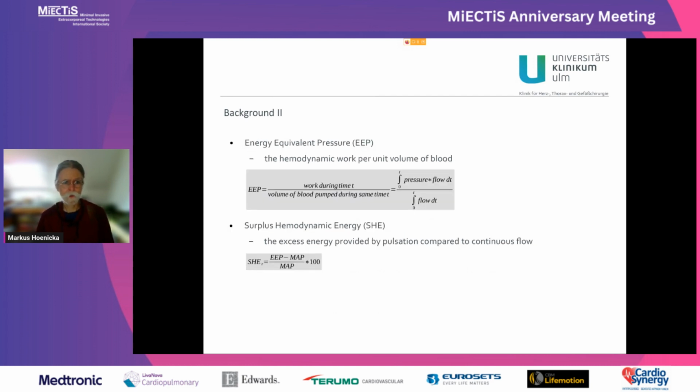Let me first start with a little bit of background, which should not be too technical. We can calculate the energy provided by perfusion from terms including the flow and the pressure. If you look at this EEP formula, if the flow does not alter, these flow terms cancel out, and EEP is simply equivalent to the pressure.